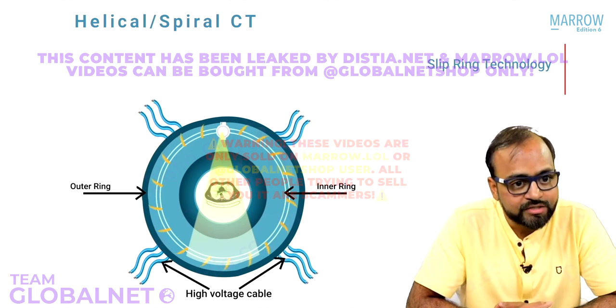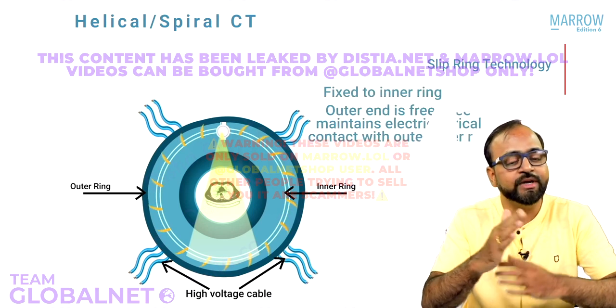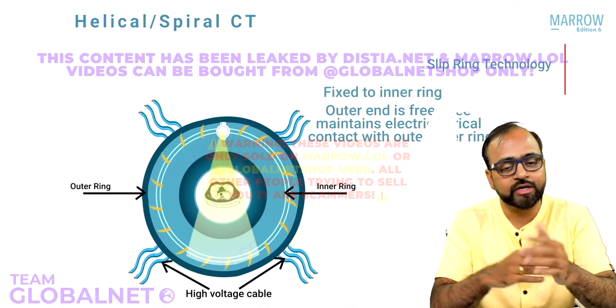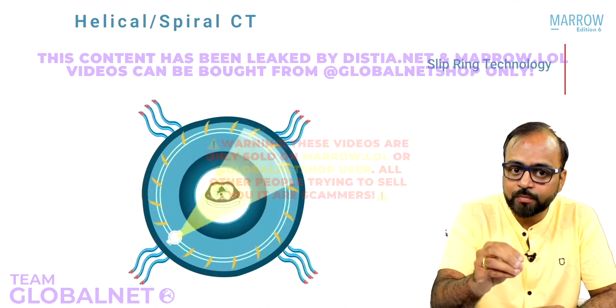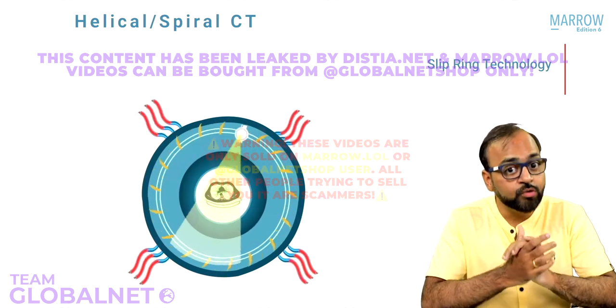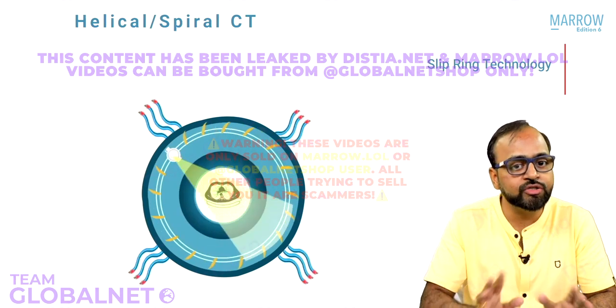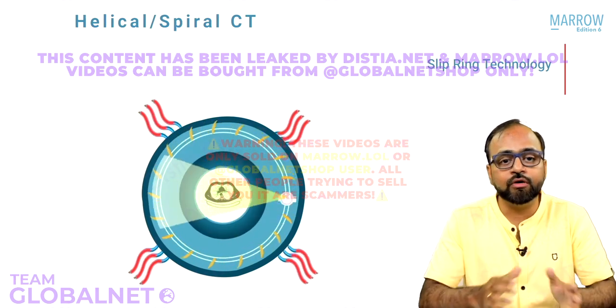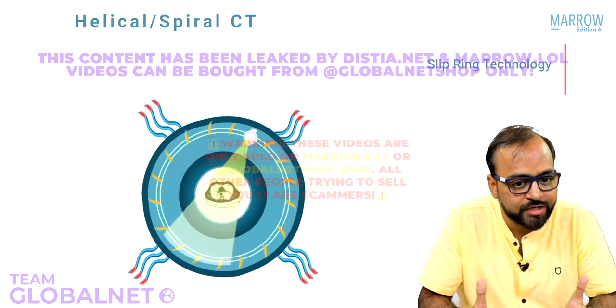These brush contactors are fixed to this inner ring. Their outer end is free. They are just maintaining physical contact, electrical contact with the outer ring. And that is how the inner ring with the X-ray tube mounted on it is free of any wired attachments. So therefore, it can rotate around the patient's body continuously without the fear of these wires getting stretched out or pulled or there being a short circuit.